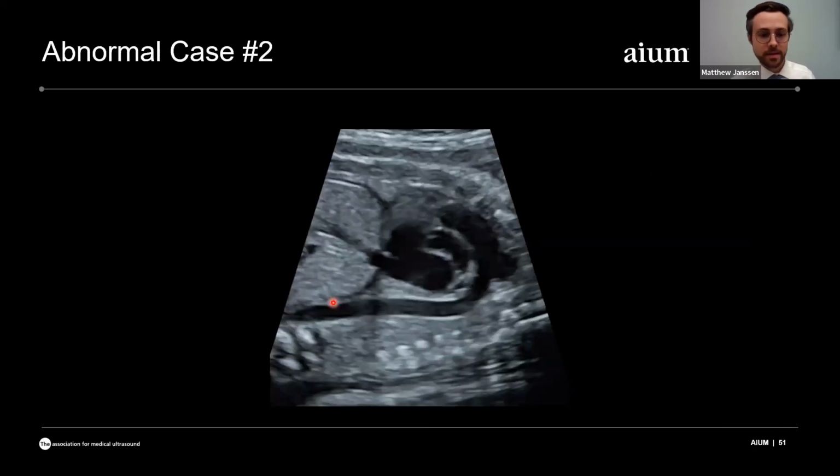And that can lead us to then assess more technically challenging images, such as finding those classic parallel outflow tracts that really are the textbook picture to confirm a transposition of the great vessels. And I think that although the 3-vessel tracheal view there with the I sign is also really clear, it also just informs us to look for these other views to really even further confirm our suspicion.